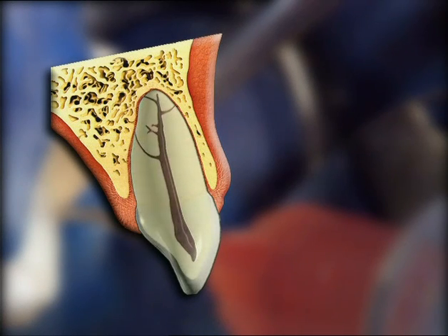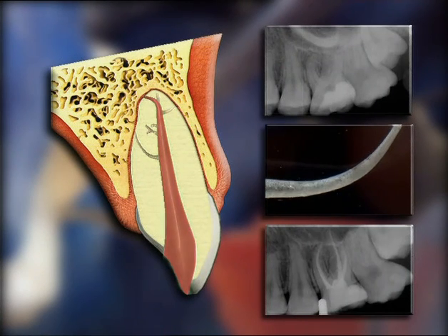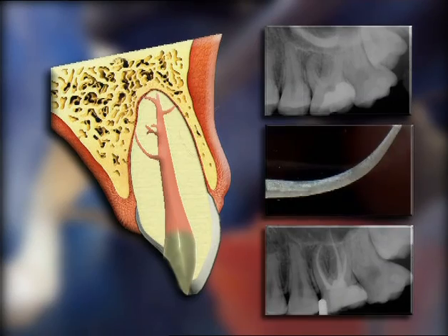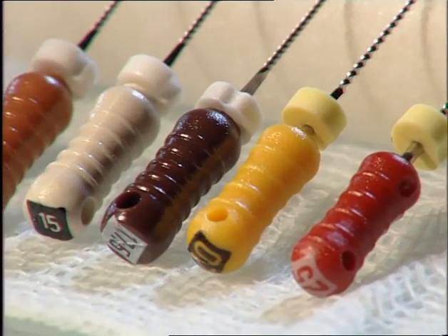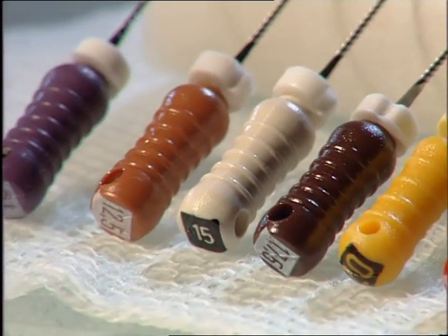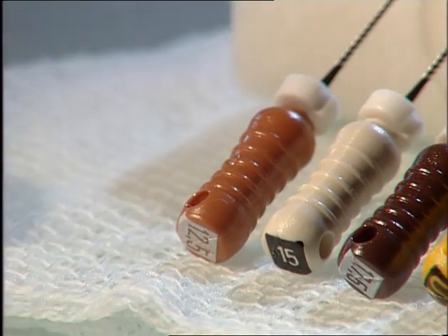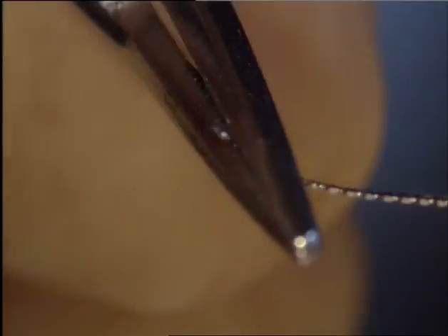Shaping refers to a logical cavity form that any dentist can fill. Shaping facilitates cleaning. Well-shaped canals consistently demonstrate well-obturated canals. In order to explore the specific anatomy, pre-curved small K-files are used first. The pre-curving depends on the root canal anatomy.